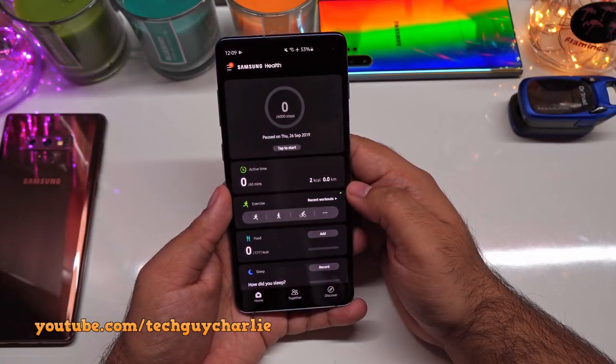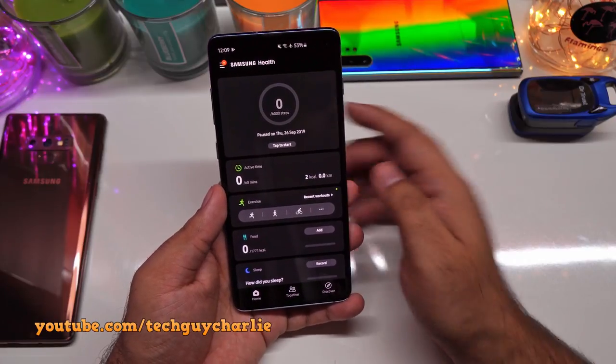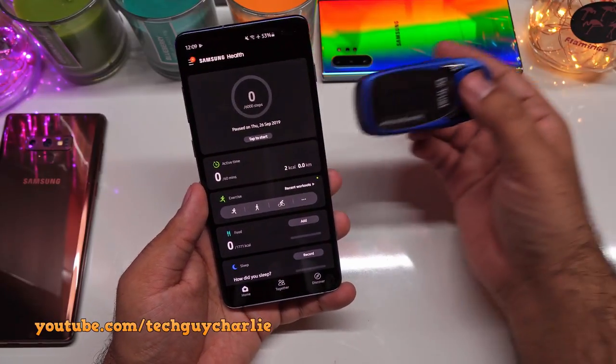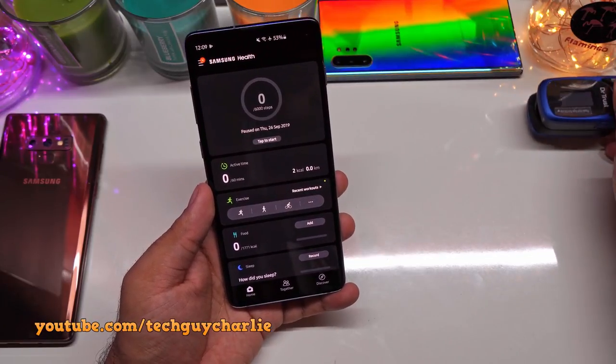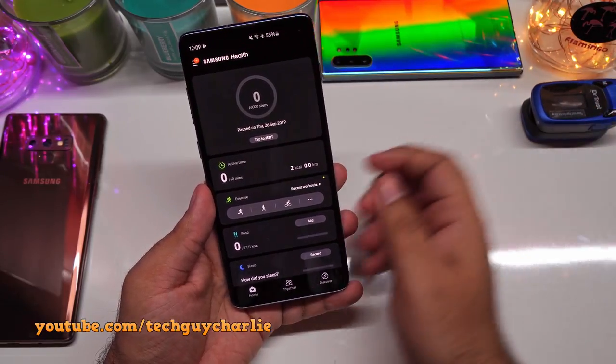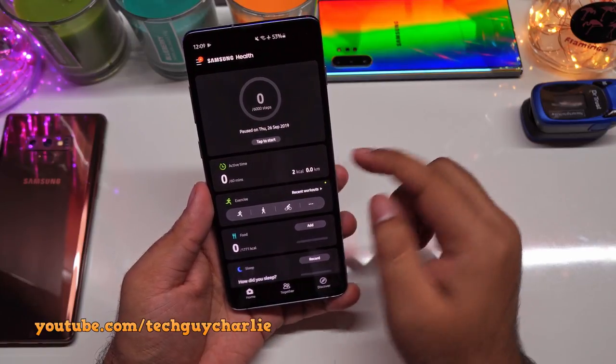The blood oxygen saturation level, or SpO2, is one of the most important figures to track during this pandemic. That's why your doctor might recommend getting a pulse oximeter. But a lot of Samsung flagship phones actually come with a pulse oximeter sensor built right into the phone.